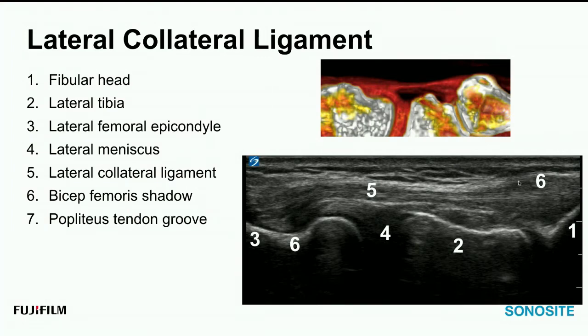Now there's a little shadow up here, this little oblique looking shadow that sits on top of the LCL. Don't confuse that for pathology. It's not a degeneration of the ligament fibers, for example. That is what degeneration of ligament fibers does look like if it's isolated in a ligament, but today's one of those days where it really helps to learn some of the overlapping anatomy at some of these insertions.